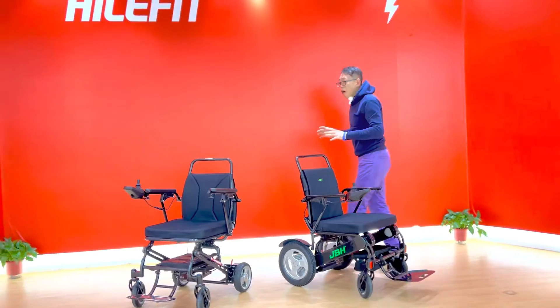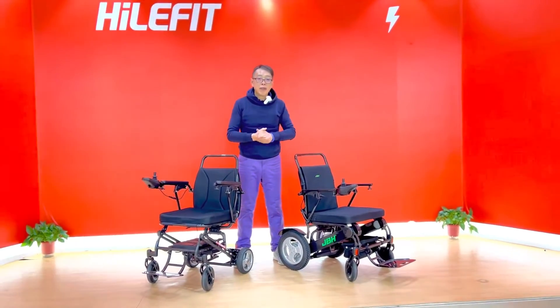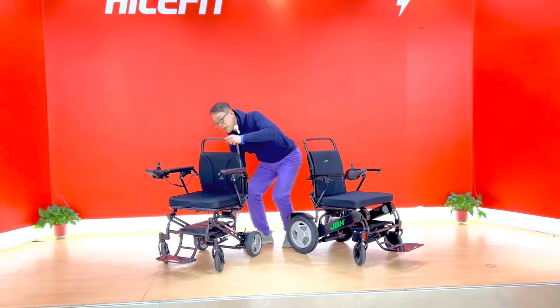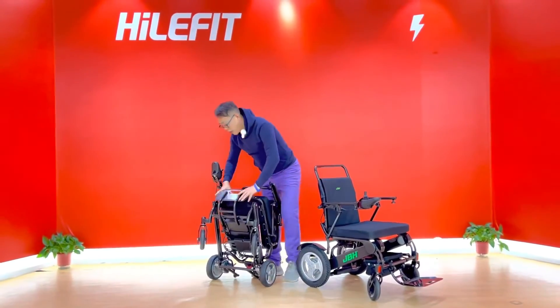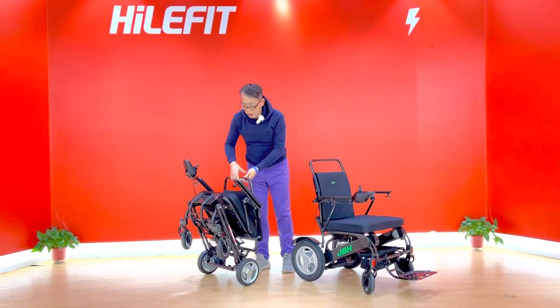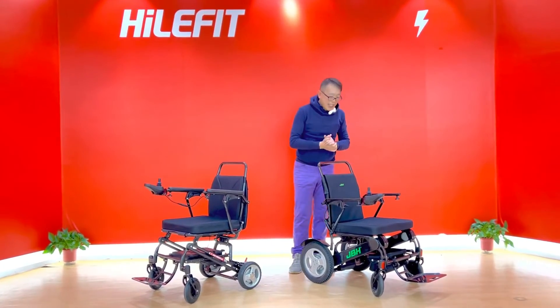These two models have different features designed to meet your demands. If you want a lightweight model that's more convenient to carry when folded, you should choose this model. It's the lightest weight carbon fiber wheelchair — you can hold it with one hand easily, no problem at all. Open it in just one second, no problem.